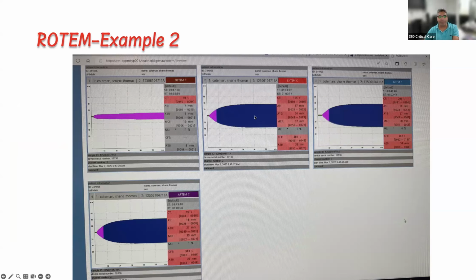Okay. Somebody says fibrinogen deficiency, A5 is less. Yes, I think now it makes sense. I hope people who are answering can see. Now the A5 here is 7, which is marginal, like 5 to 20. So it is probably less, because I showed you that graph earlier, the table with the arrow mark, that we look at an A5 of around 7 or 8 as the minimum. If it is 7, then we are in trouble.